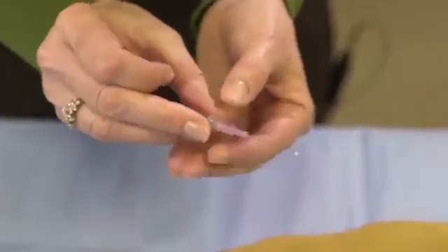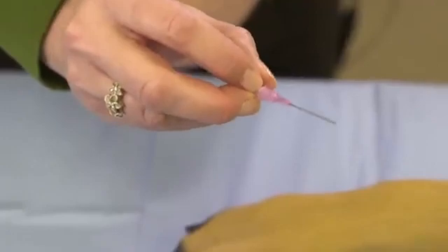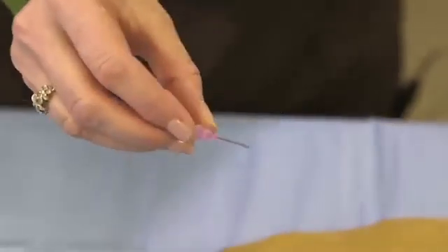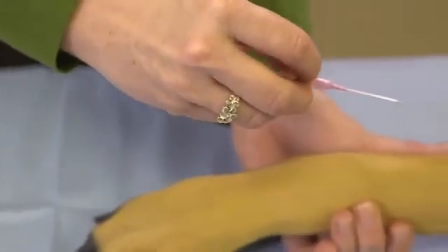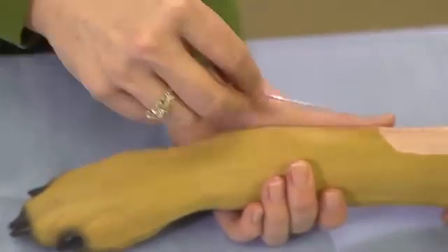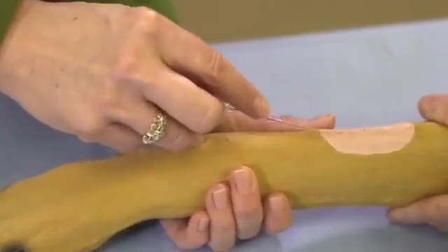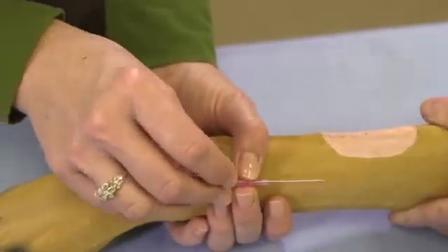Grab your stylet with your middle finger and your thumb. You want your first finger to be able to push that catheter off into the vein. One thing to keep in mind when you are putting a catheter in: when you go in, you want to push the catheter off the stylet. Sometimes when you go into a vein, you may want to actually pull back on the stylet, keeping your catheter in the same place, and then you're not pushing your catheter into the vein, if that makes sense.